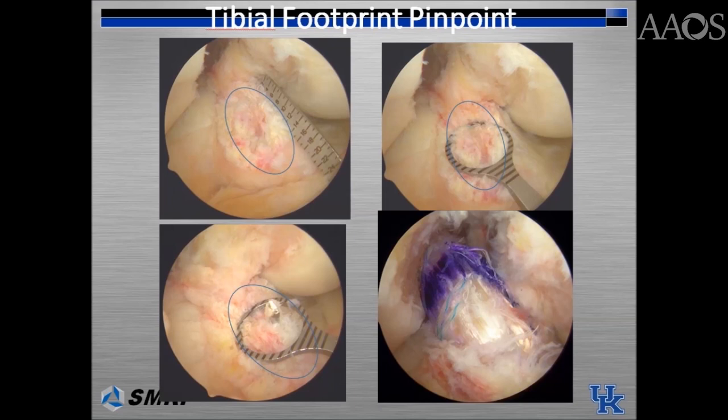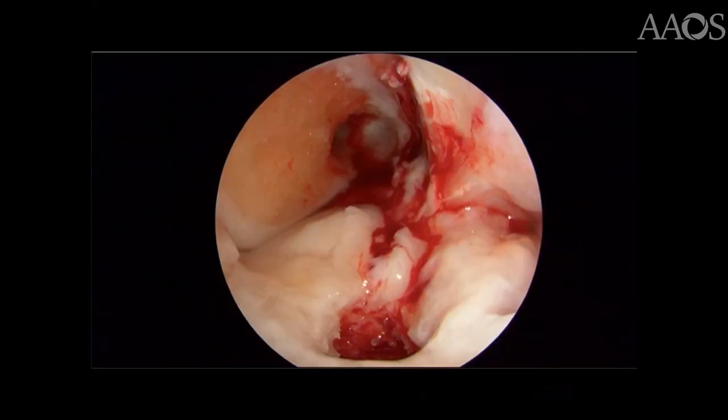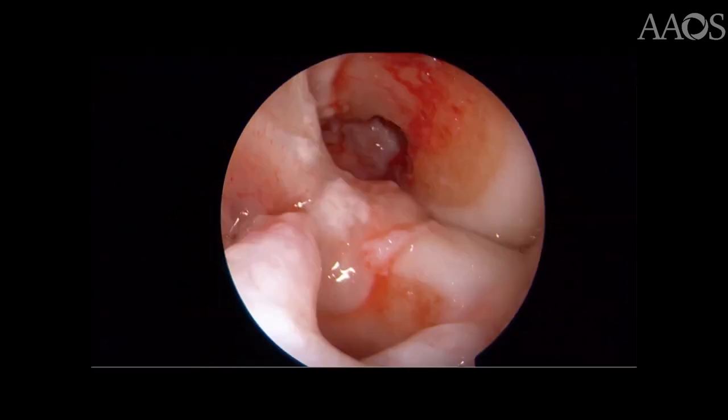This slide shows the ACL tibial footprint using a tibial guide. It is important to understand the anatomic landmarks and the placement of the tibial tunnel within the center of the native footprint. A broad arthroscopic view of anatomic femoral and tibial tunnels is seen in both of these pictures.